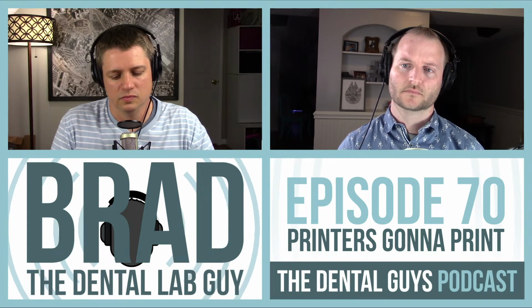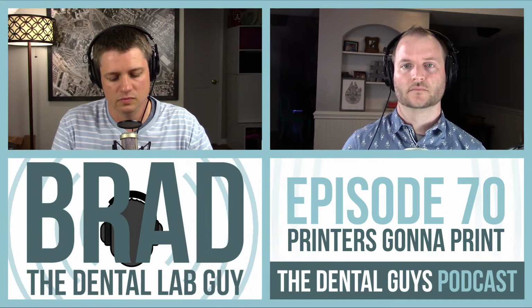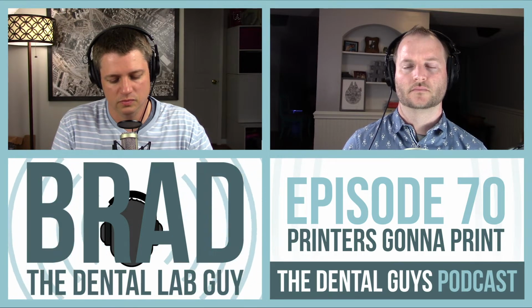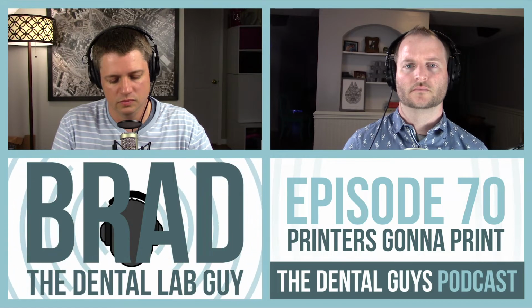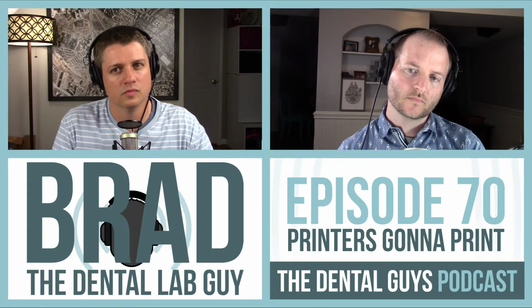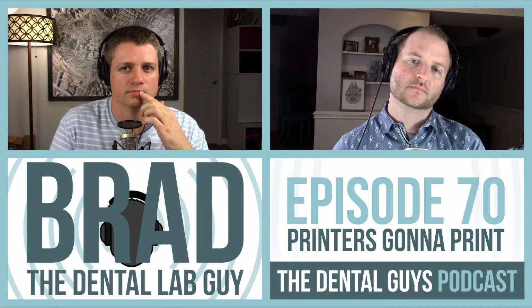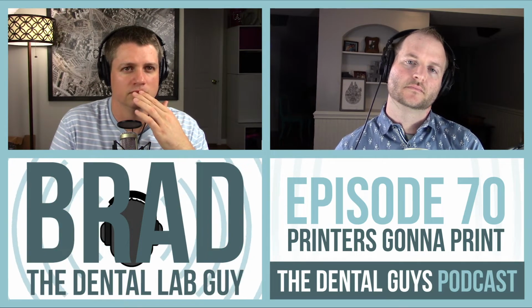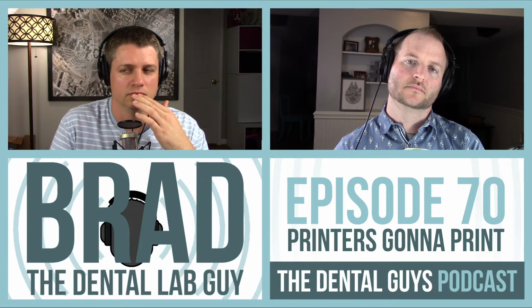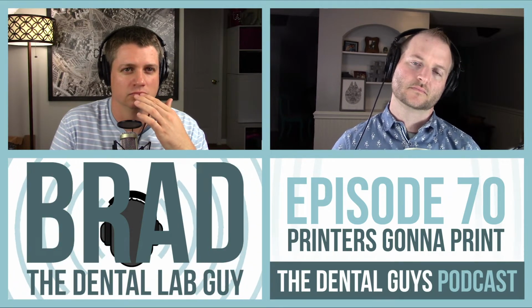But I take that same crown and go to the model, and I don't even use the model. I trust the crown fits because it was milled from an STL file, but I don't trust that it's going to fit this model. It doesn't fit the model, but it fits the patient's mouth. So what they're saying is I don't trust 3D technology, 3D printing, okay? So we in the lab, I want it to be just like an impression. I want my models coming out of my printer to fit just like I pour gypsum into an impression, and I can verify margins, contacts and occlusions if needed. That's my expectation out of my piece of equipment, just my standard that I set, right or wrong.